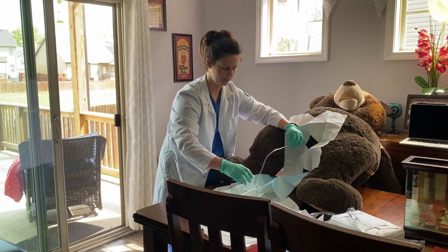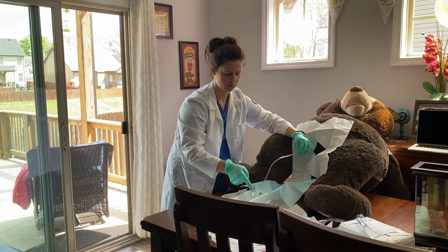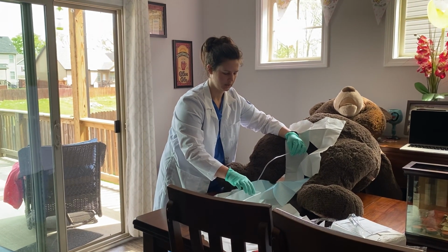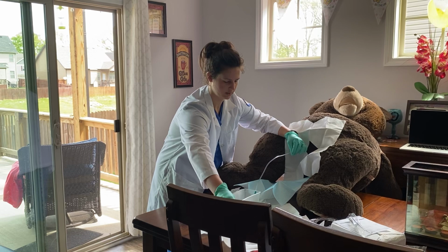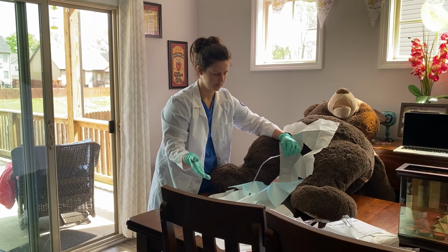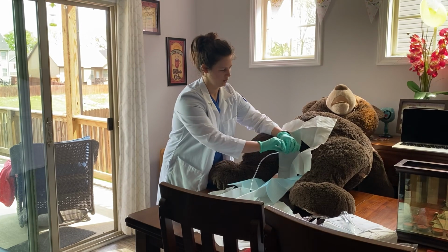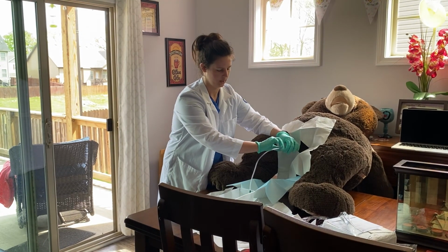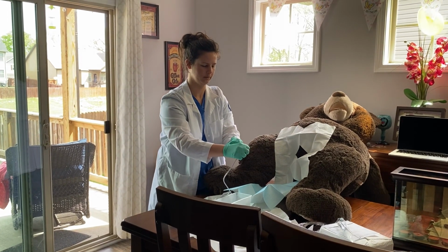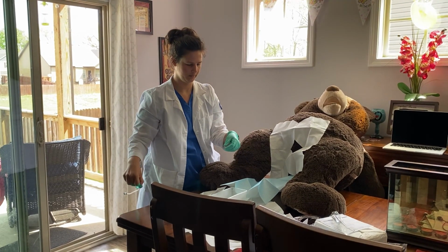Have your urine cup, and like I said before, it would be in the lock position here, and the urine would go straight into the cup there until you have your desired amount. You would take the urine cup and set it onto that sterile field there, let the bladder drain, and then once the urine has stopped, you can remove the catheter out, and you can take your glove and hold it over the catheter like that so that you can throw the whole catheter away.